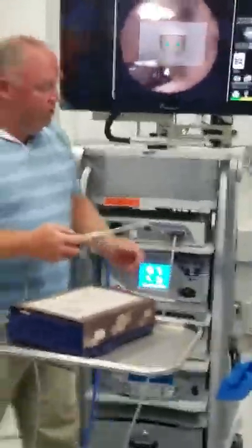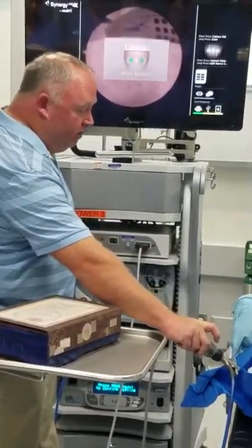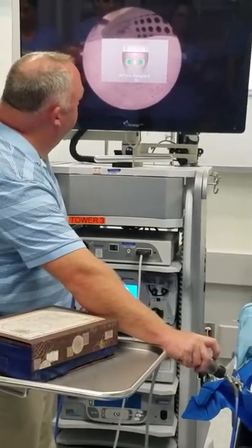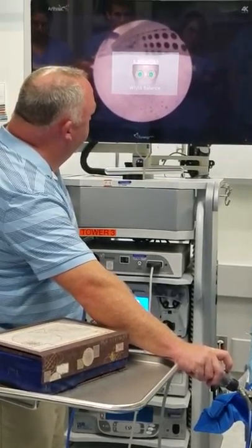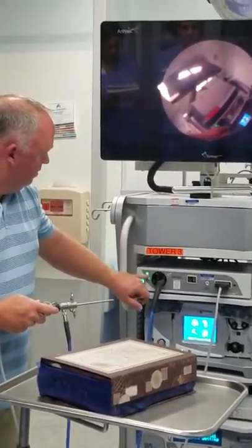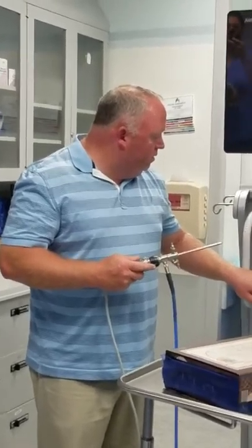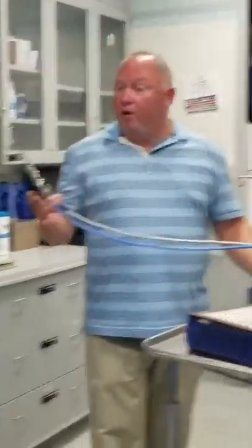White balance. That is basically to get an idea of the color, so I put on something white. That's close enough. We have white here. We have a camera now. We have a light, we have a camera, kind of ready to go. Good. What it allows us to do now is go ahead and get ready with our scope.